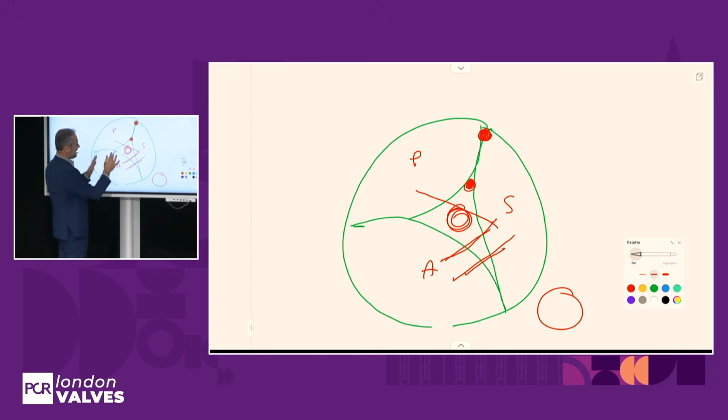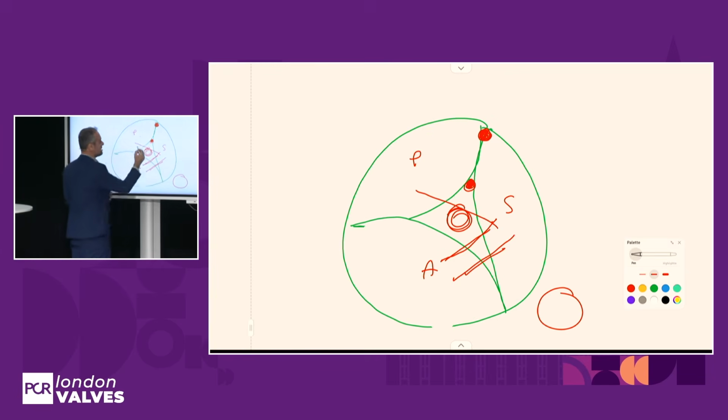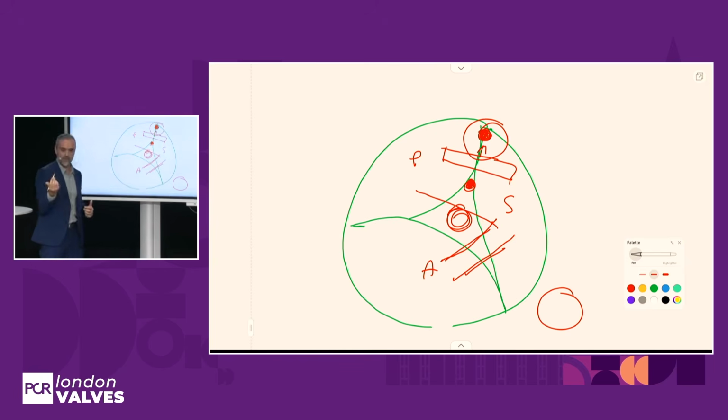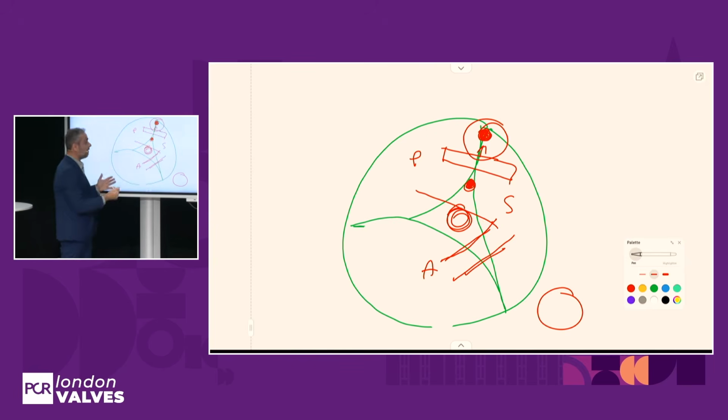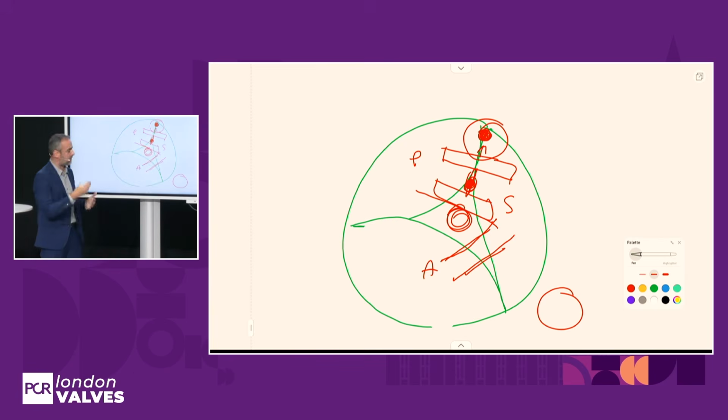When I was talking about jailing, it means that you can jail the lead in the commissure, because you're limiting the movement of the lead. Sometimes you cannot do it. In very few cases you can also jail it among clips, so the interaction is going to be less. This is extremely difficult, but it has been described and has been used sometimes.